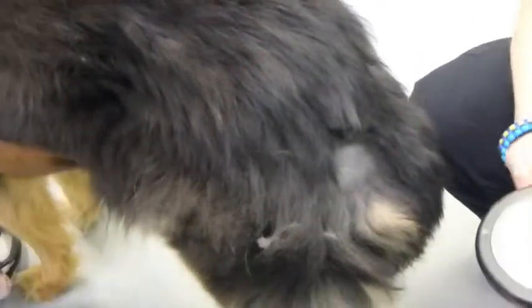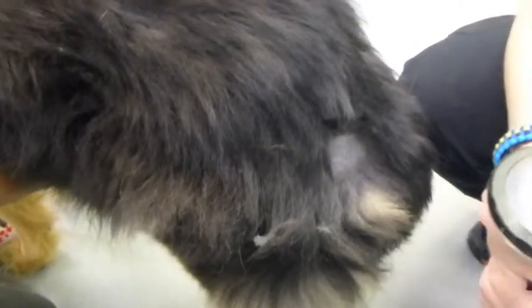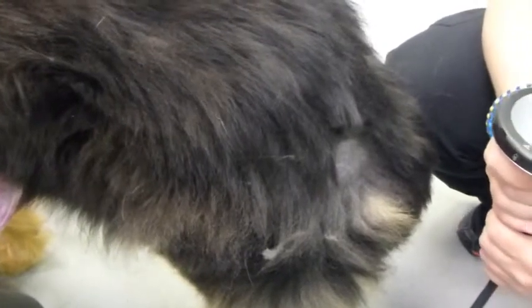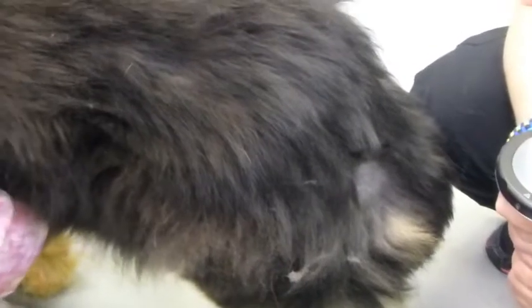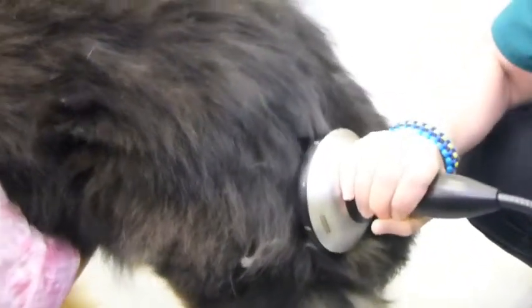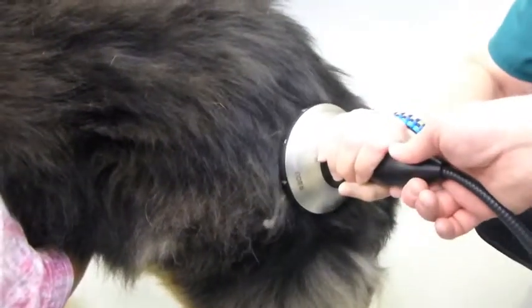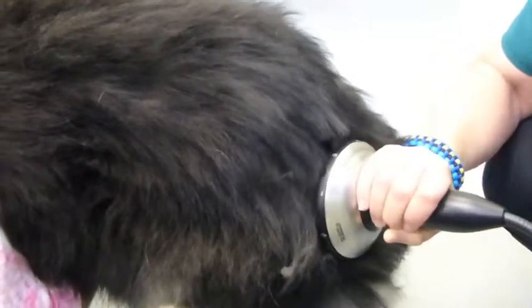I'm going to go ahead and start. Do I move it? You're going to try to move it. You're going to just tell us if you get a little tension or something where she's indicating. Just kind of slowly move it around there, real slow, until you find a spot right on that hip.